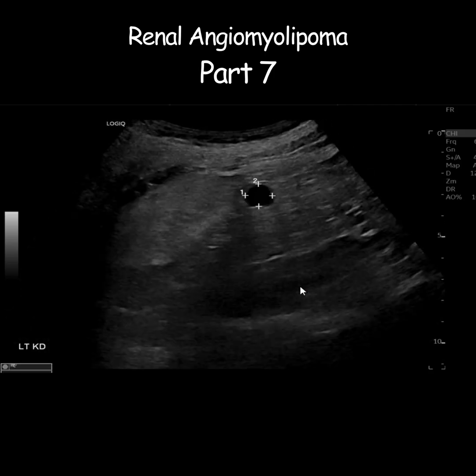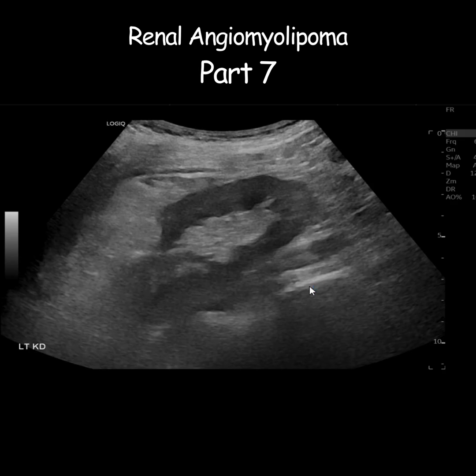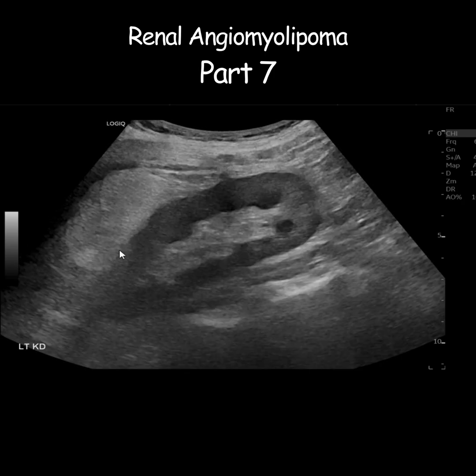Well, I've already found it. Okay, these images are a bit better. You can see the left kidney — its nice cortex here in the interpolar region and lower pole. But here in the upper pole of the left kidney, you can see a fair density area which is scalping the renal cortex. That's where this lesion is. This is another very beautiful image — you can see almost the whole lesion here, and it's nice and homogenous. It does not show any fluid component to suggest bleeding.